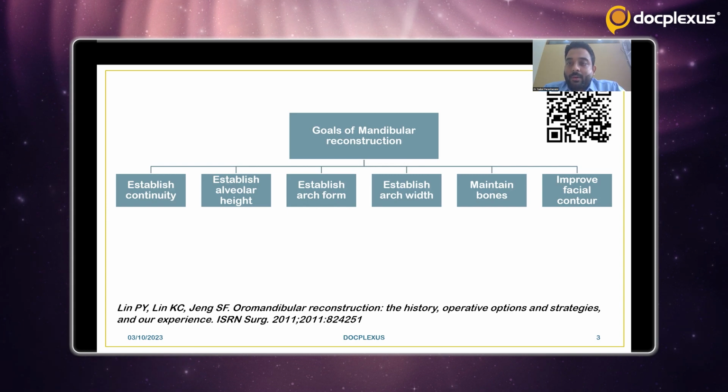Mandibular defects following ablative surgery for malignant tumors of the head and neck region impact both form and function and require a multidisciplinary approach to optimize functional and cosmetic outcomes. The goals of mandibular reconstruction are to re-establish the form of the lower third of the face and to restore the patient's ability to eat in public, be intelligible to both trained and untrained listeners, and to maintain an unencumbered airway that allows freedom to perform all activities. The geometric design of the inferior border of the mandible also defines the aesthetic contour of the lower third of the face.